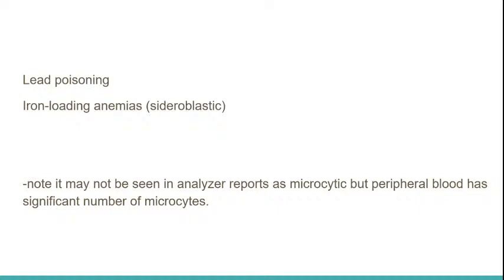So you see the importance of looking at the samples under the microscope. I think it would still take a couple of centuries for automation to catch up to human intervention. So looking at the slide is still an important factor in our practice. We still have an edge over machines.